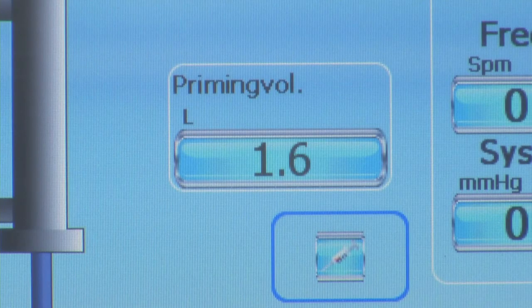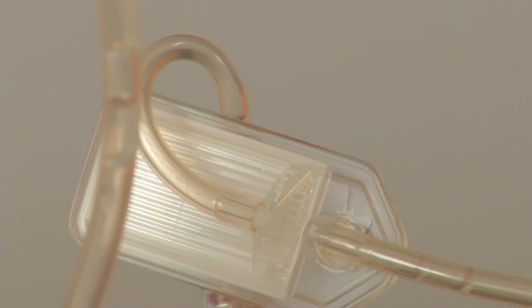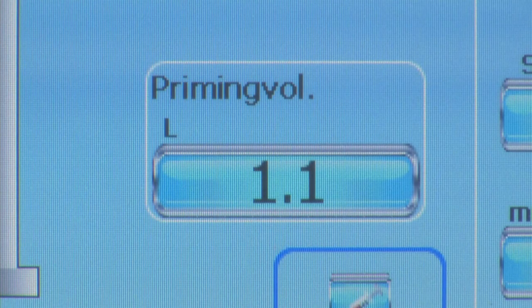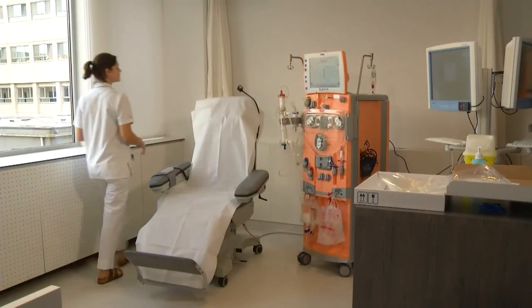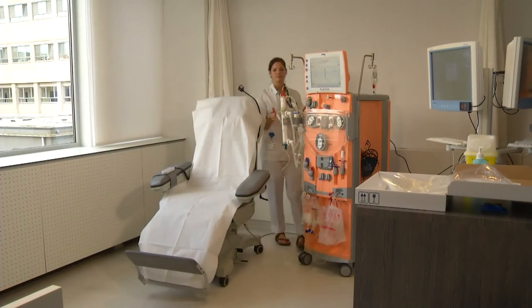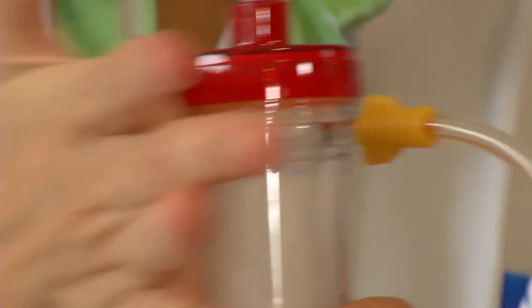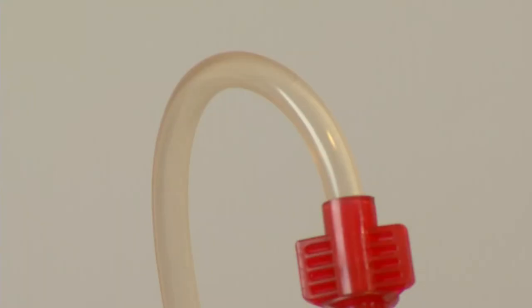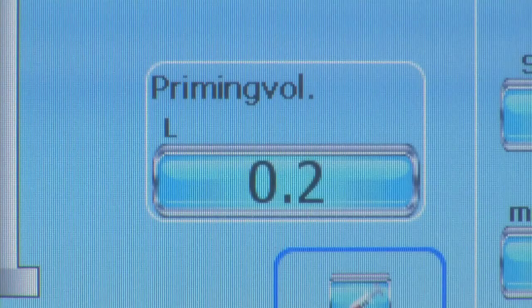We only start with priming when the patient has arrived. This to avoid a standstill of the liquid in the circuit. During the priming, 2.5 liters of substitution fluid flows through the circuit. This happens in stages, so as to eliminate all air from the circuit. When the priming ends, the device is ready to connect the patient to the dialysis machine.